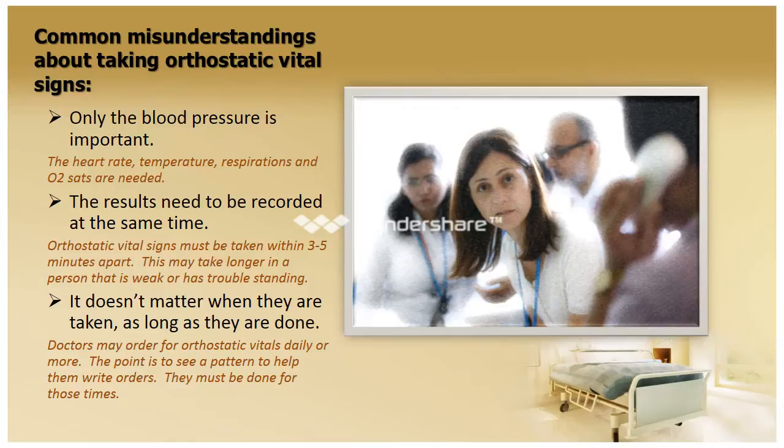Recording them at the same time, again, we will discuss that later, but typically we would like them to be taken within 3 to 5 minutes apart, and this could be a little bit delayed when you have a patient that has severe weakness or has trouble standing. Make sure that you have a spotter or an extra person in there to help so that you don't injure yourself as well as the patient trying to lower them to the floor in a situation like that.